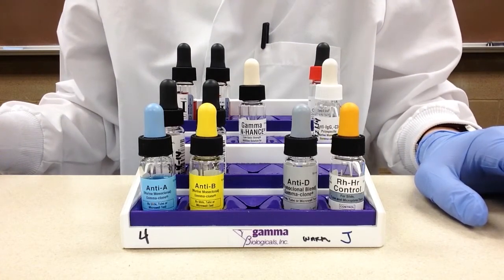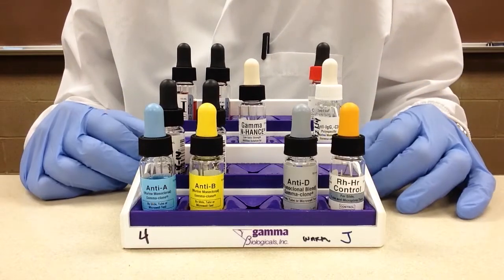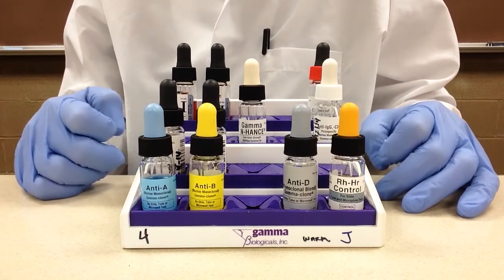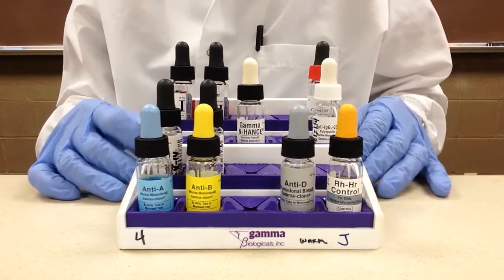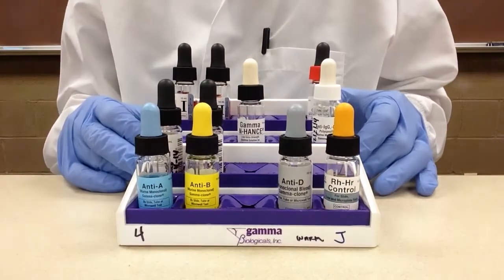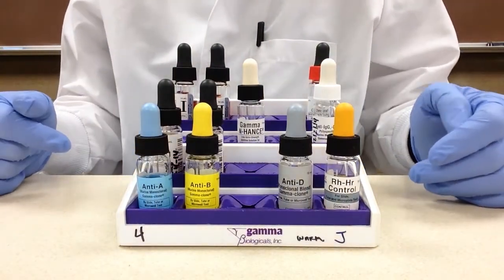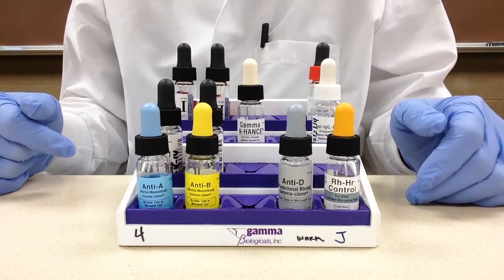Another rule is that the reagents are put in a certain order. We have four of these racks in our lab and it doesn't matter which one you pull out — all reagents will be found in the same spot. The last rule is that all reagents must be facing forward at all times.